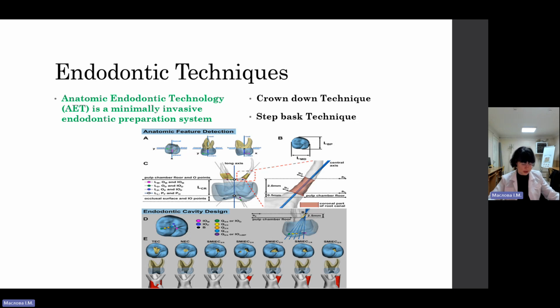With this technique, one attempts to give the apical 2 to 5 millimeters of the root canal a cylindrical shape rather than the tapered shape of the step back technique. In this way, it is hoped one can obtain clean walls consistently in the important apical part of the root canal. K-type instruments are used with filing and rotary cutting action: stainless steel file sizes from 8 to 20 and nickel titanium file sizes 25 and up.